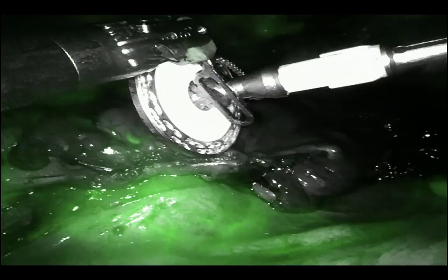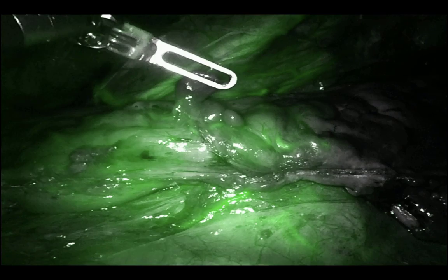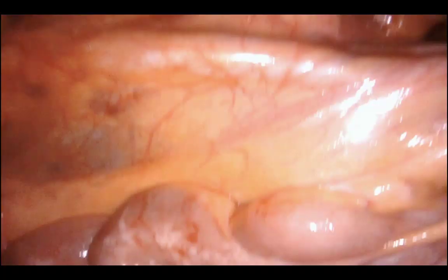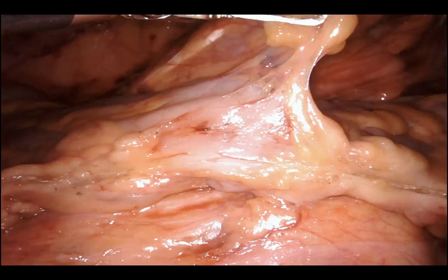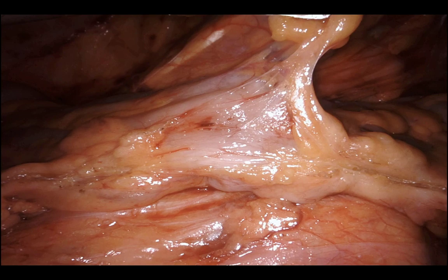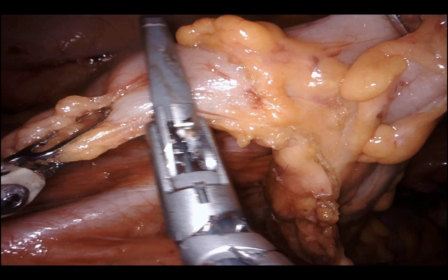The anvil just went in. My bedside assistant removed the stapler port, extended the skin incision slightly, and introduced the anvil into the abdomen in the most delicate and elegant way possible — with a little fascial stretching. In larger patients with deeper sub-q it's more difficult, but whatever works.